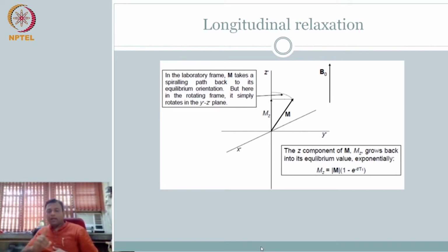So therefore, there is another important concept or one important tool, right, to play this game you have, which is: I have a signal which is transverse. I know the signal is coming only from the transverse component. Now we talked about dephasing, so the signal is going down. So what happens if I want them to rephase again, right? How do I make it rephase again?